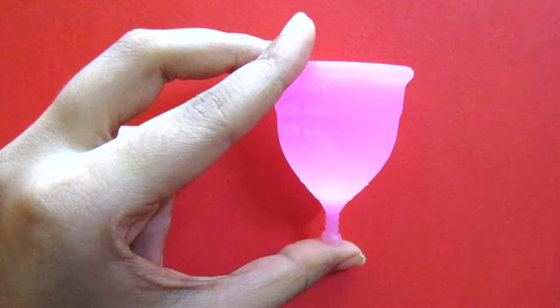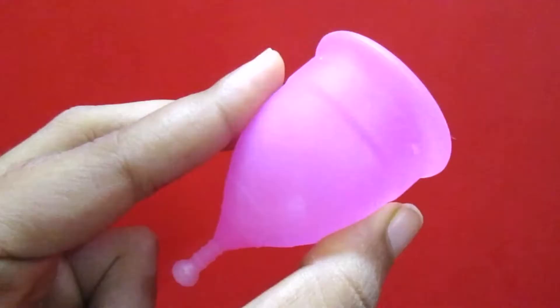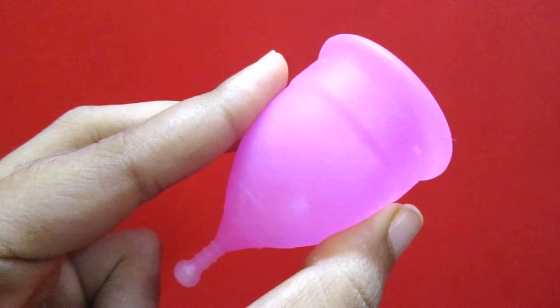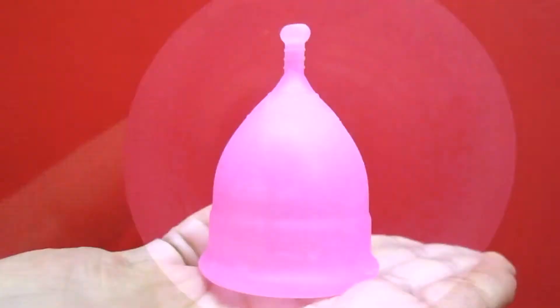Now let's look at how this cup looks like. This is the rim, and these are the holes — they help to create the suction inside your vagina so that it won't fall out. This is the base of your cup, which you have to pinch down to release the suction when you are removing it, and this is called the stem, which helps you during the removal process.